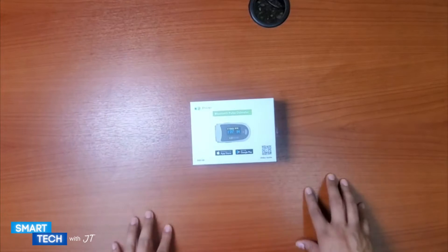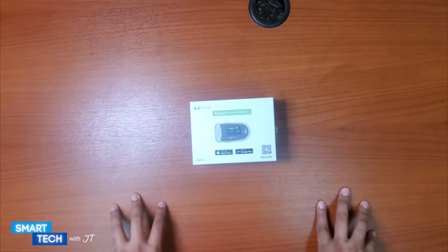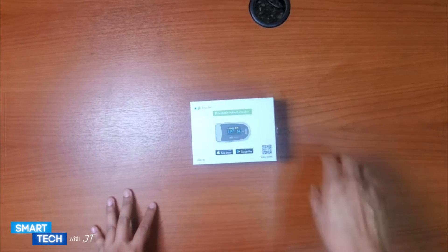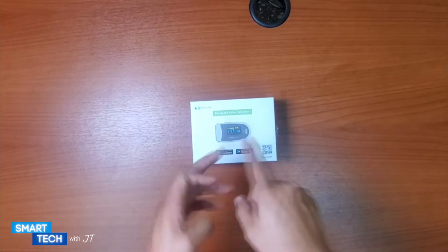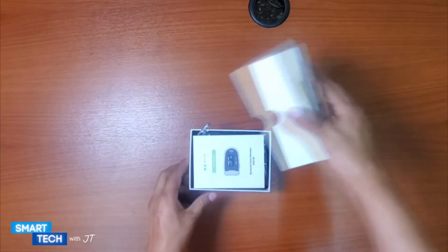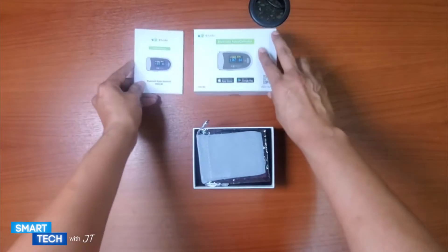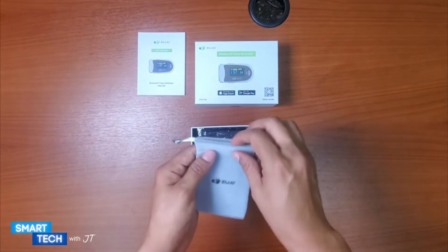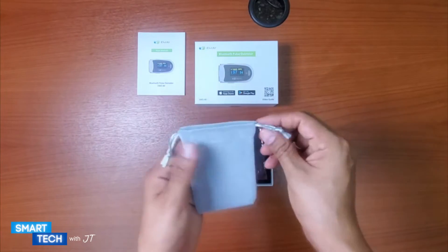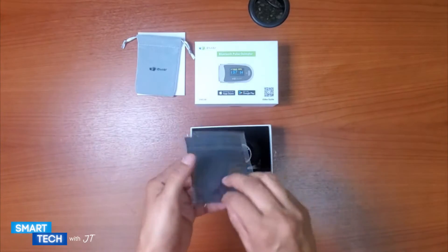Are you looking for a way to track your oxygen level and heart rate while sleeping? Are you somebody that may be suffering from sleep apnea? This little device can help tell you whether or not you might have sleep apnea. I purchased this personally because I have sleep apnea — it's a really great device that tracks my oxygen level and heart rate all night.